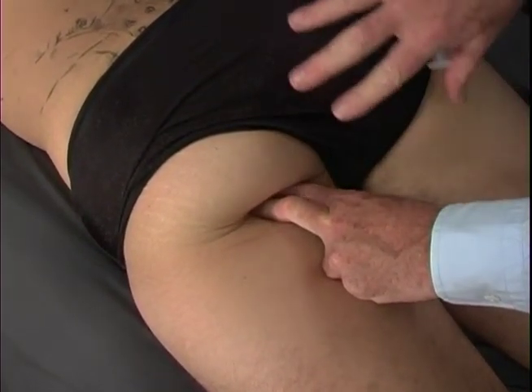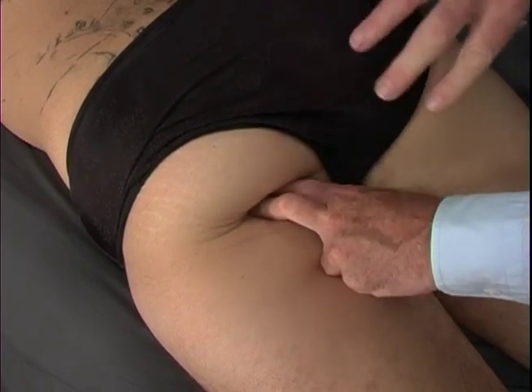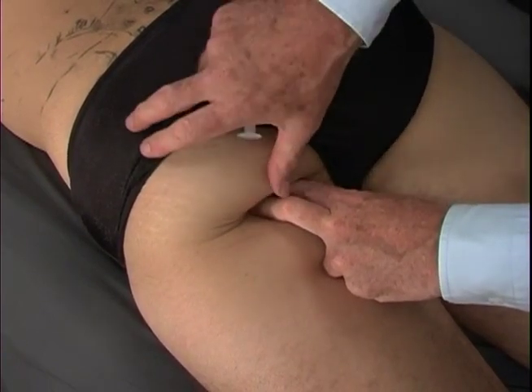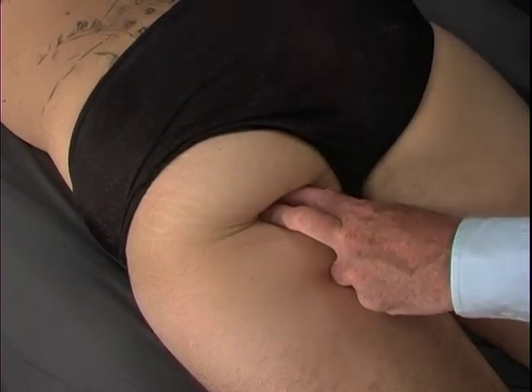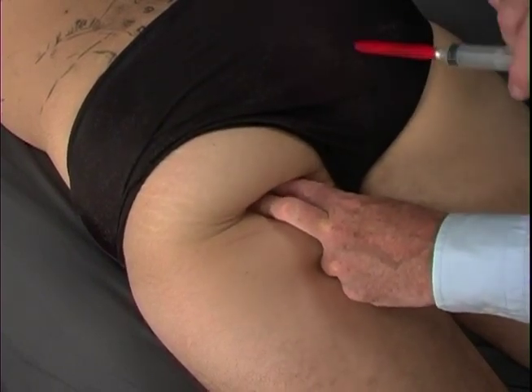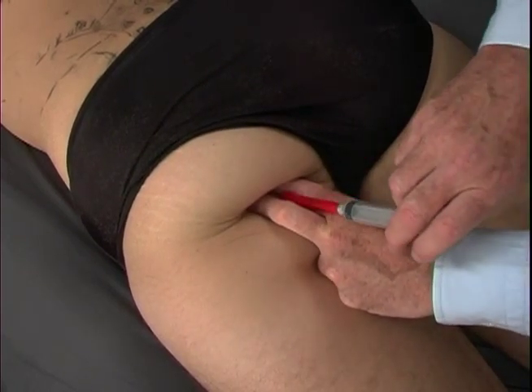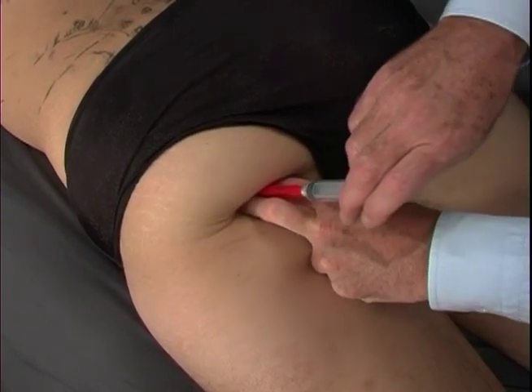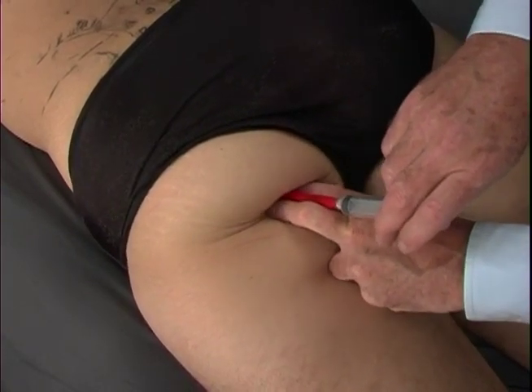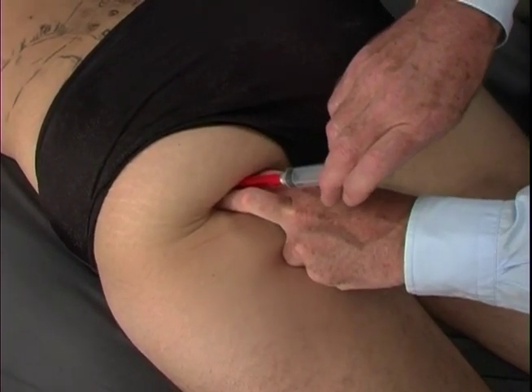The biceps femoris hooks into this area, and the semitendinosus, and then the semimembranosus further in, but the semitendinosus medially on the ischial tuberosity. We then keep our fingers pressed firmly in, because there's a lot of tissue here, and come in directly with our needle onto the ischium and walk around with our needle, coming out to the skin level to reorient and do the skin sliding in this way.